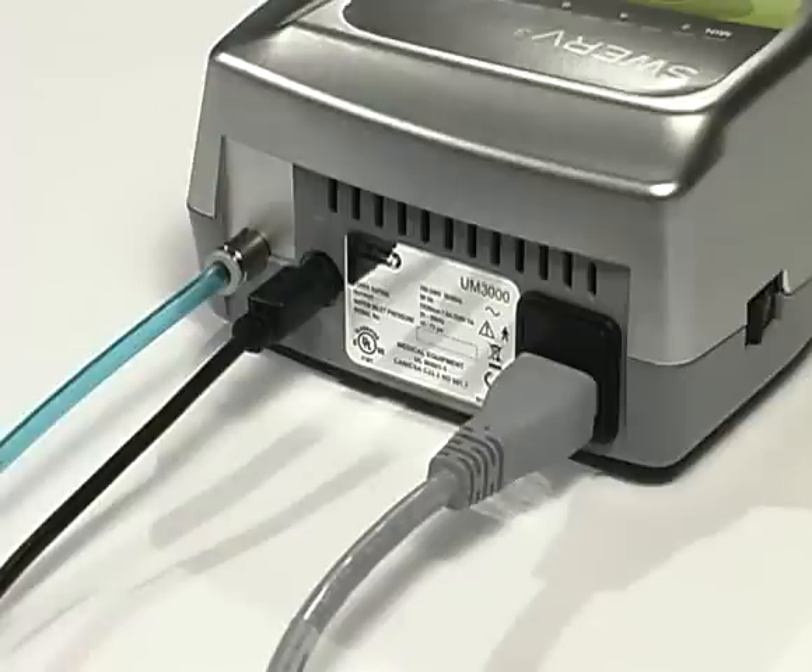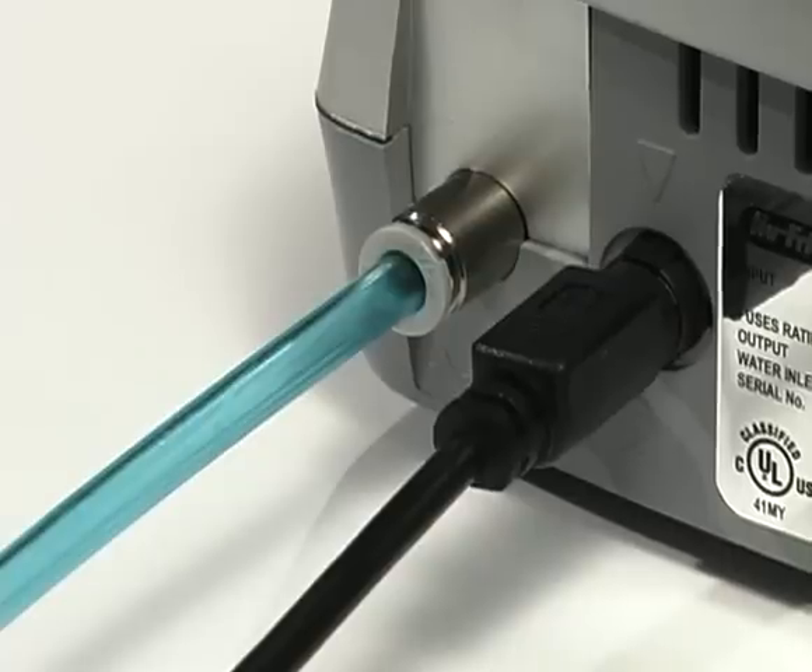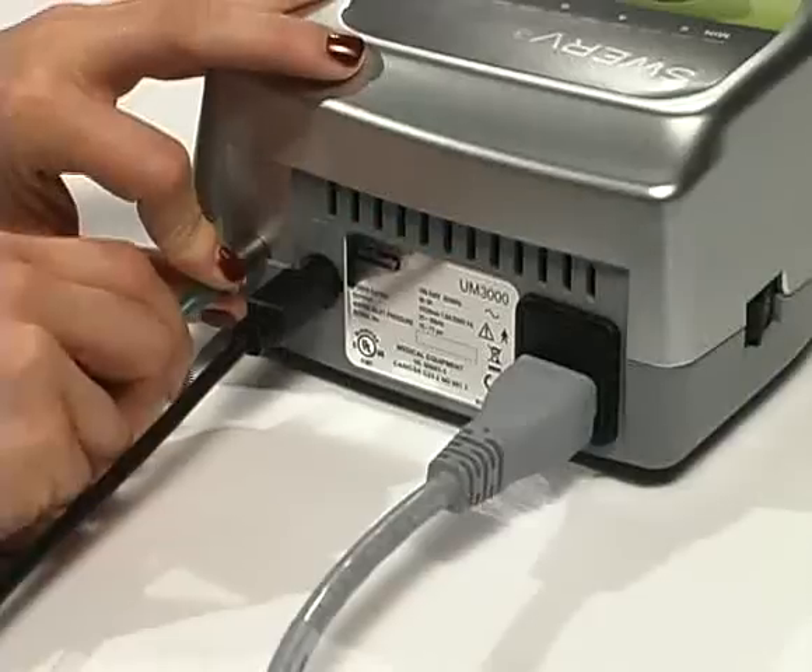To remove the water tube from the control unit, push in the white ring and gently remove the tube.